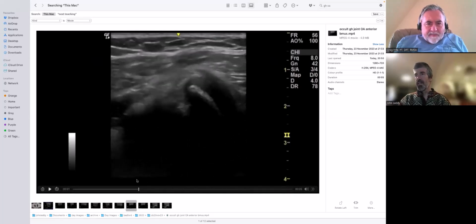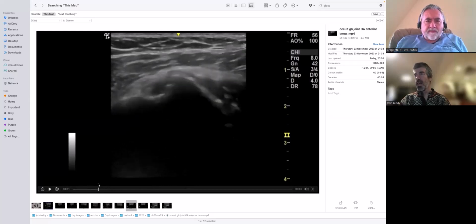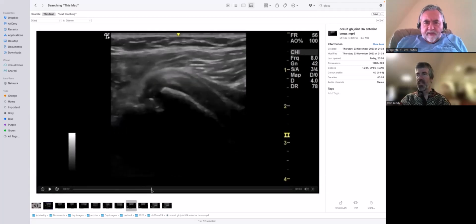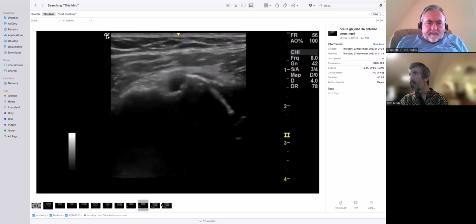Okay. So you're looking at the bicipital groove. Ignore the quality of the image, and you will go into extension, and you can see that here the boundary with the articular surface is abnormal. We're going into external rotation, seeing the subscapularis, looking at the subscapularis clearly being stretched over osteophyte. Let's have a look. Where's the next one? Okay. Joint anterior.